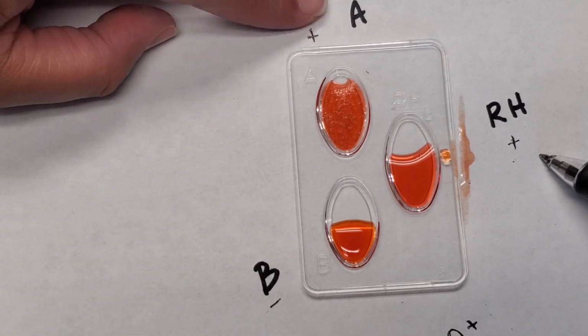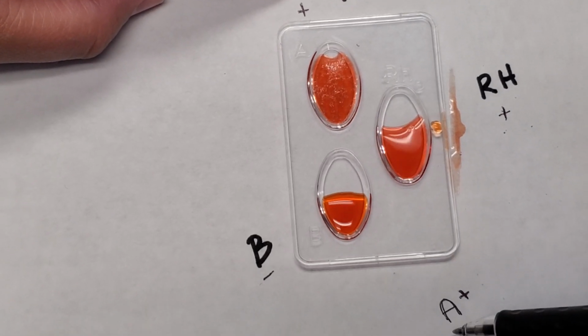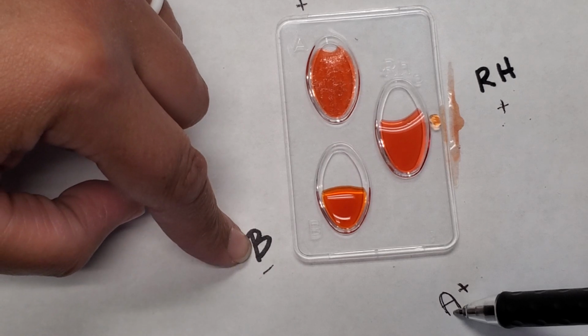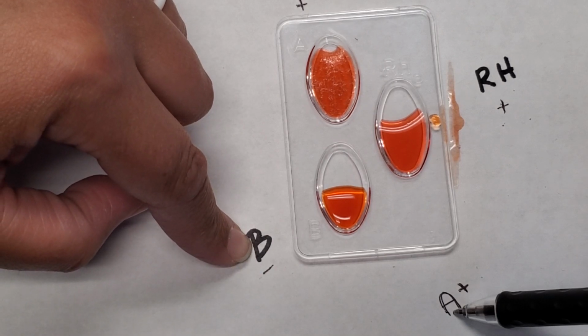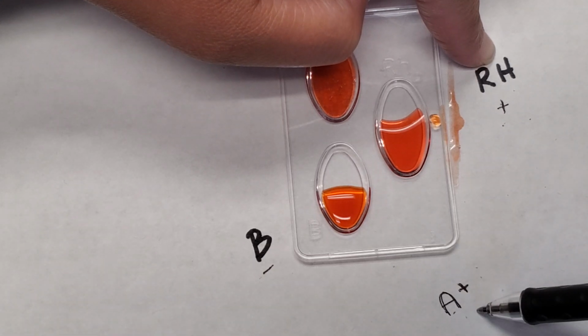So again, with this specific blood type that we're looking at, we had a positive result in A, which means we have blood type A. Negative result in B, which means B wasn't there, so it's just blood type A. And again, we had a positive result in the Rh well, which gives us our positive blood type.